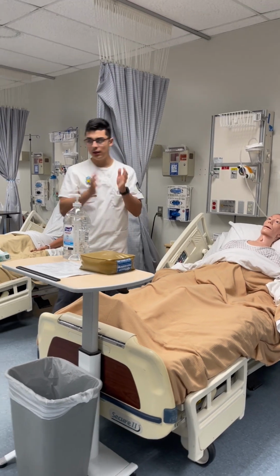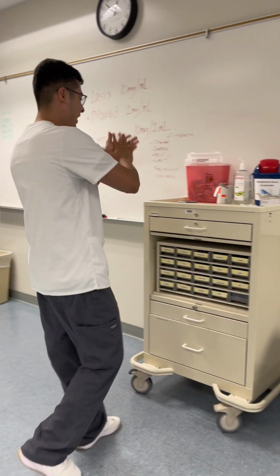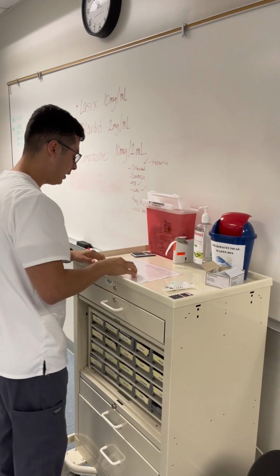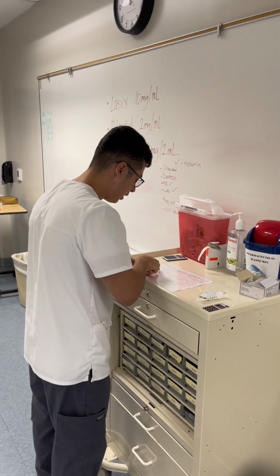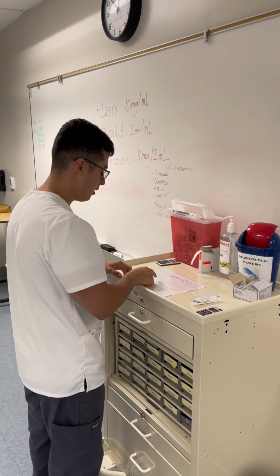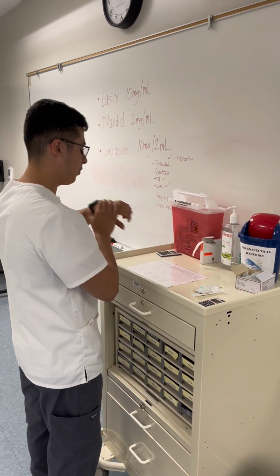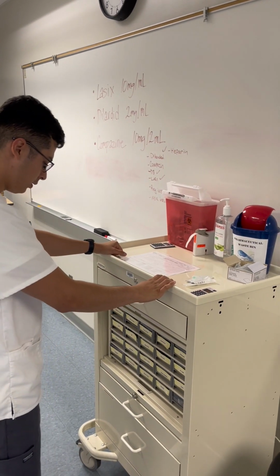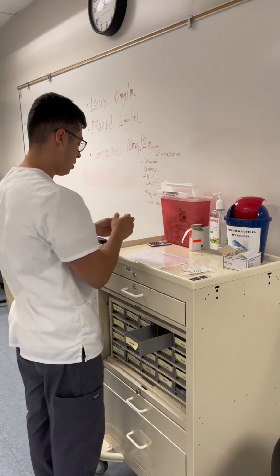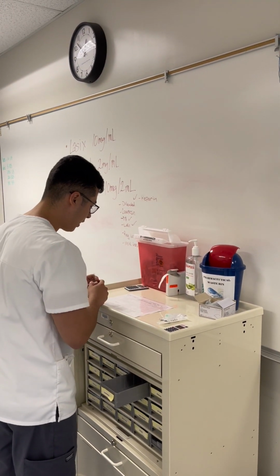Okay. Alrighty. So I hand hygiene out of the patient's room. Hand hygiene into the medication room. So I'm going to do my first med check. We're going to be giving my patient Angel Pena Compazine 5 milligrams intramuscularly as needed for his nausea and vomiting. And right now it is 12:50. So we're going to be taking out my Compazine. Let's see here. So this is Compazine. This ampule is not expired.